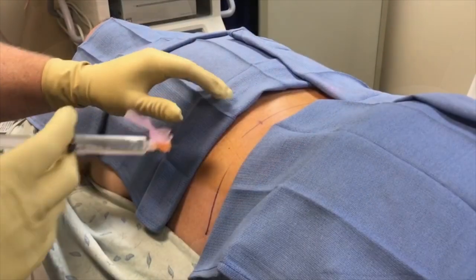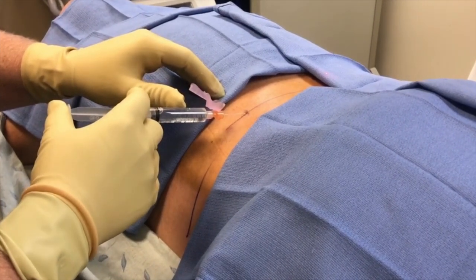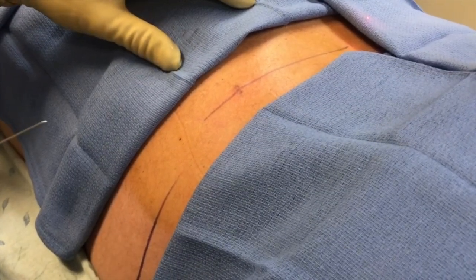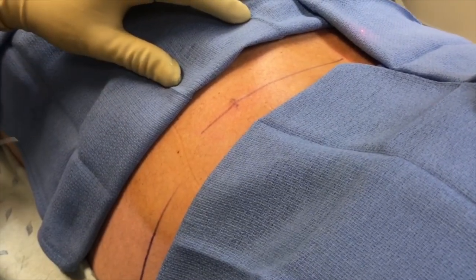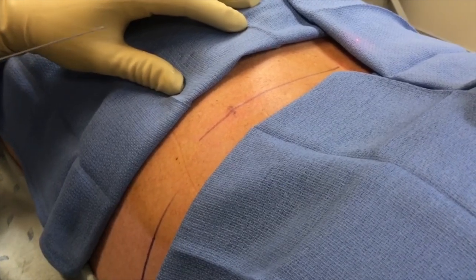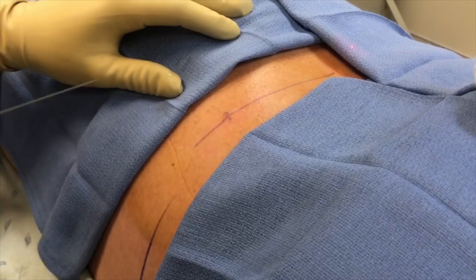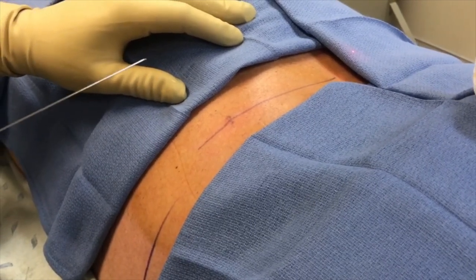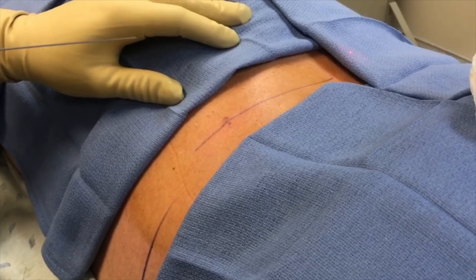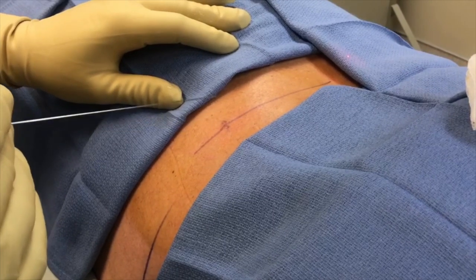Now we'll prep and drape this area. If this were an endoscopic approach, we'd have the full Joy-Max bag with the water bags. We anesthetize the skin at the mark because that's where we're going with the needle and the endoscope. Since this is a transforaminal epidural, I use a 20-gauge 6-inch needle; for the endoscopic procedure we use an 18-gauge needle so that the guide wire will fit down the needle. Our target is the lateral aspect of the facet joint — we want to go dorsal and medial to the exiting nerve root and land on the lateral aspect of the facet, ideally where the facet and joint capsule converge with the intertransverse ligament.